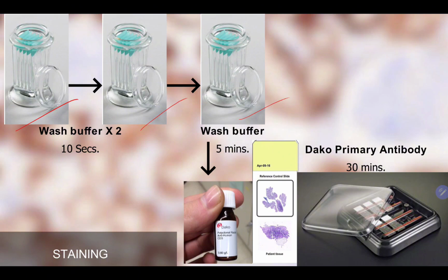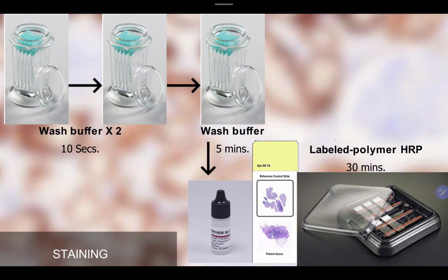In this case, we have the CD3. But let's say, for example, the breast panel earlier, it might be ER, PR, HER2 that you put here. Same thing, the Dakopen is there. The Dakopen will prevent the primary antibody from escaping. Then you put it in the moist chamber. This is the staining part, the primary antibody. After that, wash again.